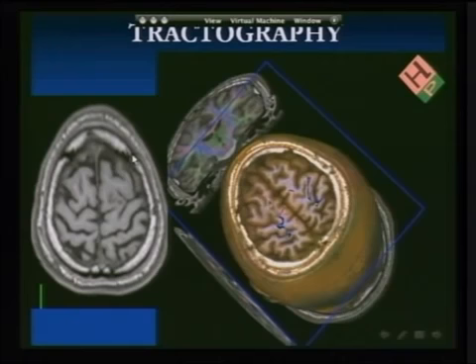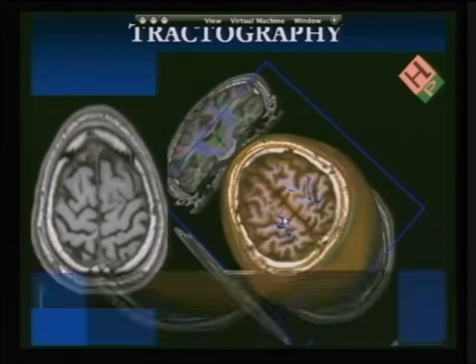On the axial series, here is the mass. When we are using the advanced package, we are seeing from above, while here we are seeing from below. This is why the left side is here on the imaging, and the left side is on that side on tractography. And we can see that the mass is here, the tracts are deviated posteriorly and medially.